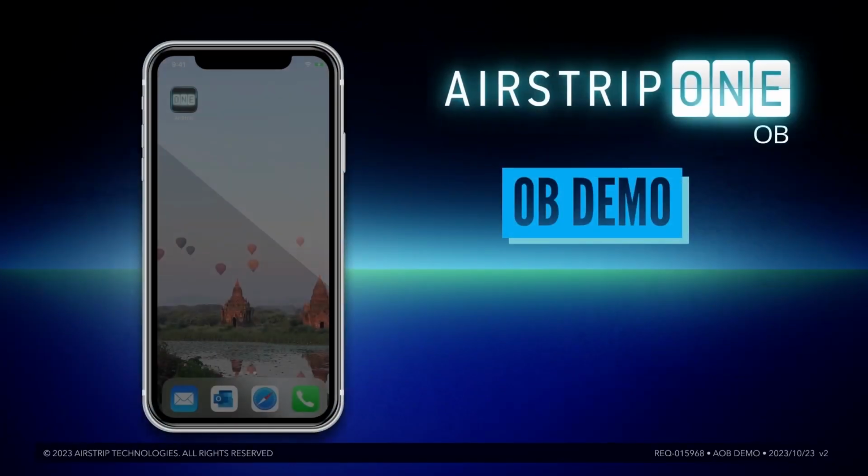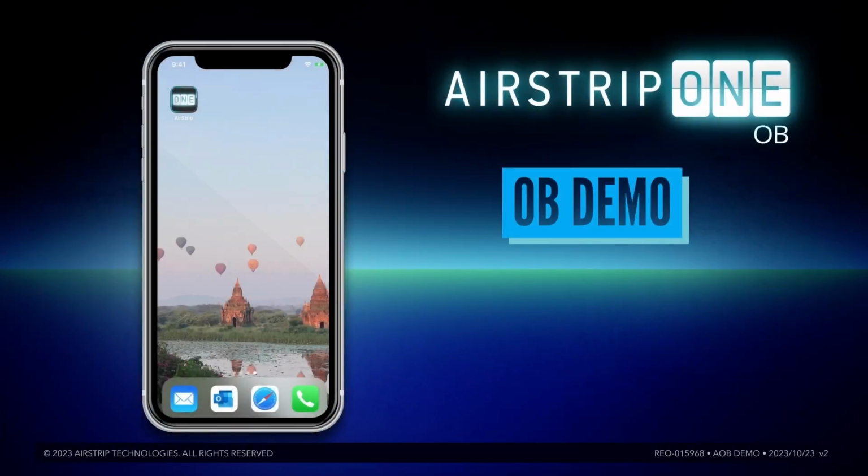Hello, and thank you for joining us today for a demonstration of AirStrip ONE's OB module.